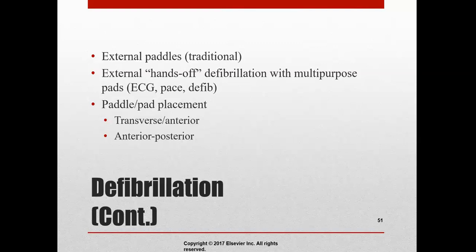Really, paddles have been used for years, but they require the gel, and the pads are just so much more efficient at delivering the current, and they're way less messy and provide for a safer hands-off approach. But regardless of the type, the correct paddle and pad placement is important.